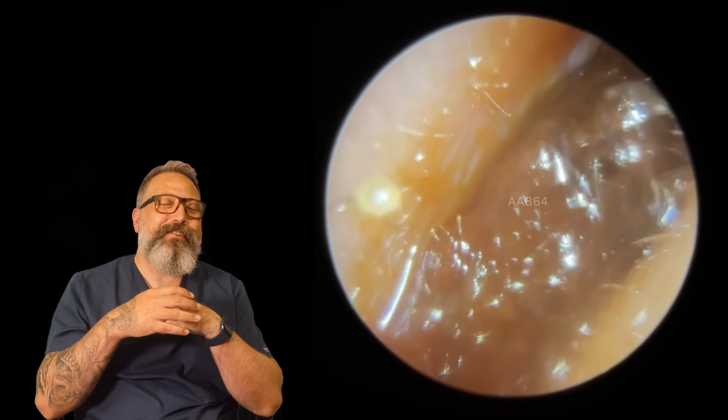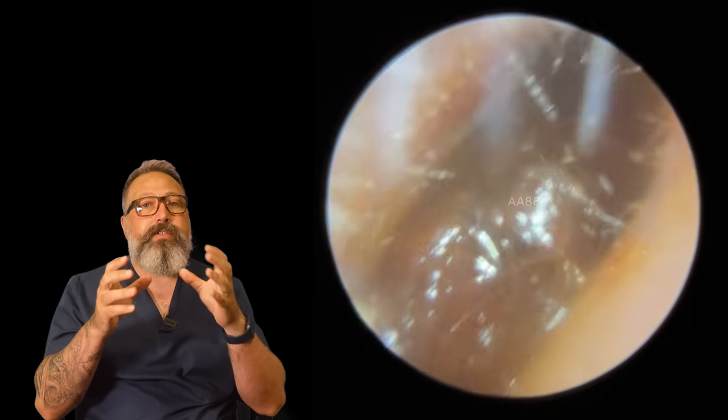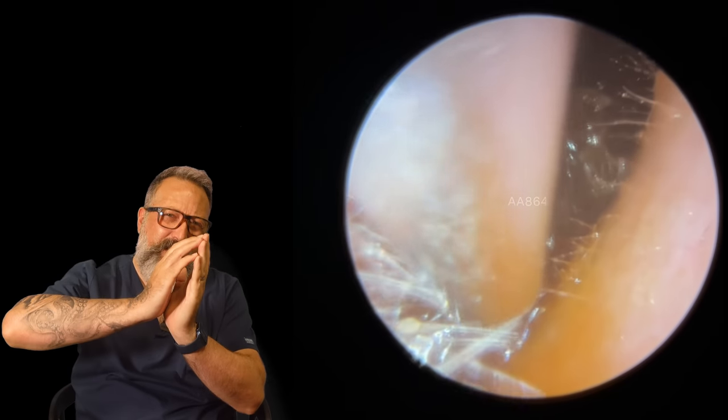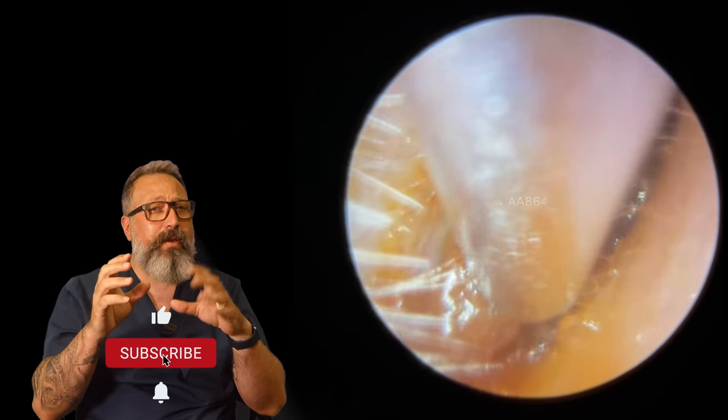Hi everybody, this is Rhys Barber from Audiology Associates. Thanks very much for watching our ear wax removal video today. What you can see here, we've got quite a narrow ear canal that sort of narrows and twists a little bit. That's quite common in ear canals.